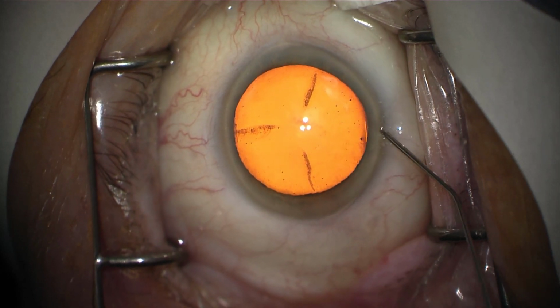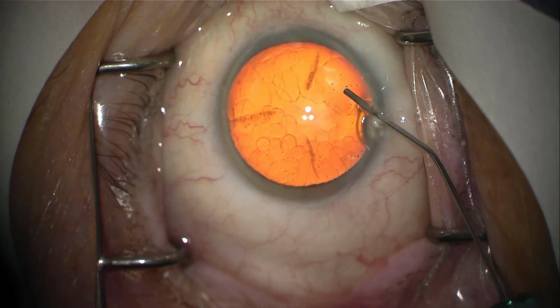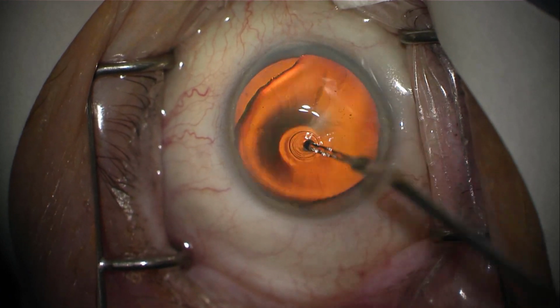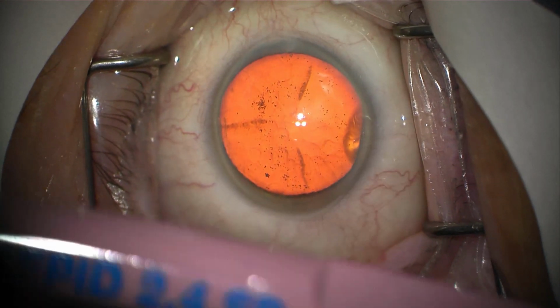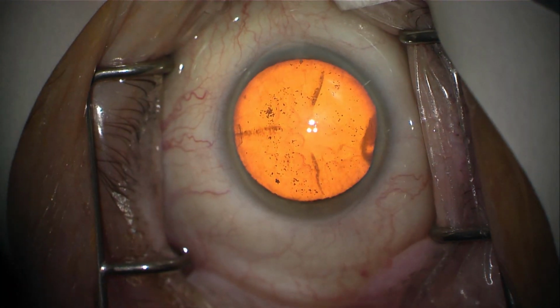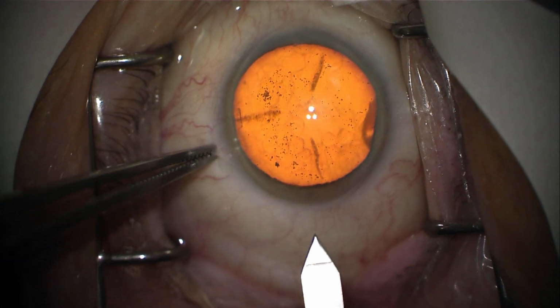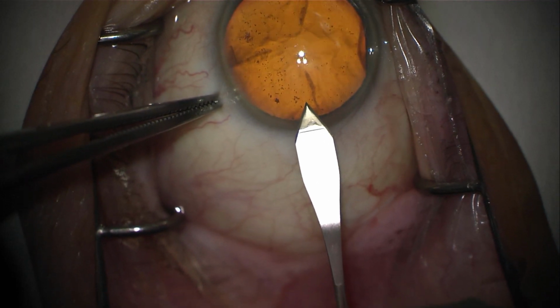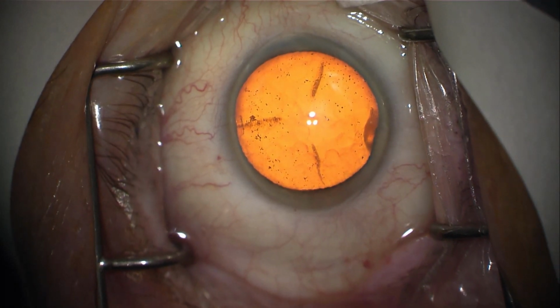What I'm doing now is injecting a gel into the inside of the eye, what's called the anterior chamber. You can see it's a thick gel, and the purpose of this is to inflate the eye. I now just squirted the eye with some saline solution to keep the cornea moist so that it doesn't dry out. Next step is I use a 2.4mm blade, a very sharp blade called a keratome, and I basically insert it into the cornea. I'm holding on to the eye with a small forceps on the white part of the eye so that the patient doesn't move their eye during this delicate incision.